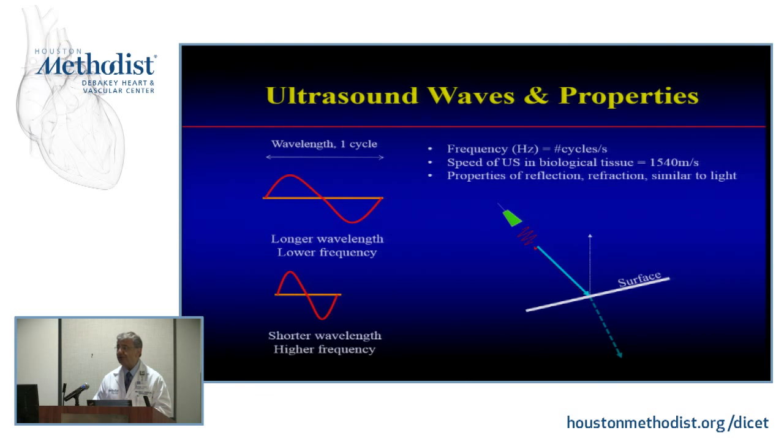And interestingly enough, for us to be able to record from the same transducer, you have to have this tiny fraction that comes back straight to you, right? So just imagine how much of the energy of these waves that are sent into the body is reflected straight to you. So number one is you get back to the transducer a very tiny fraction of what you emit.